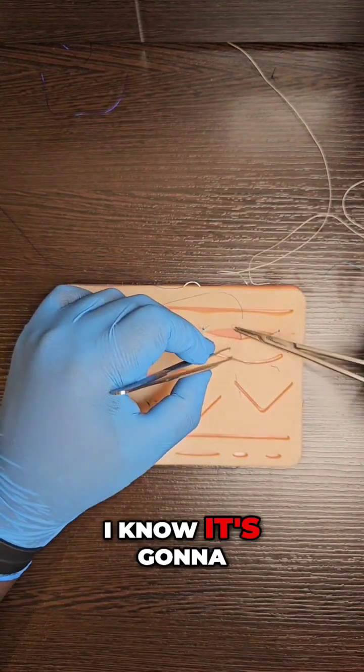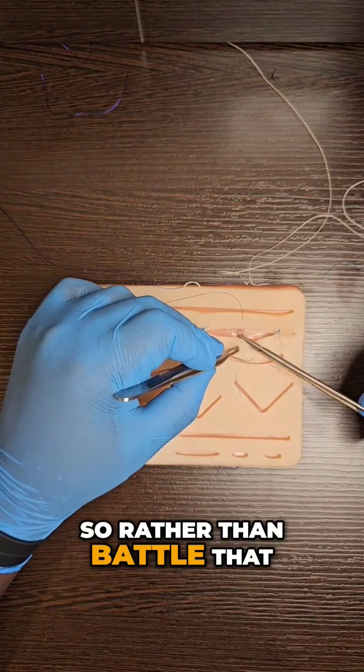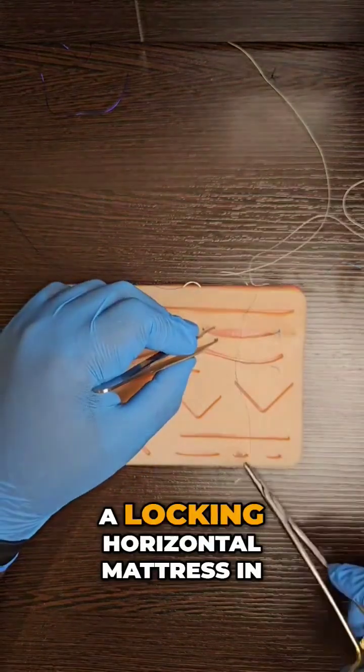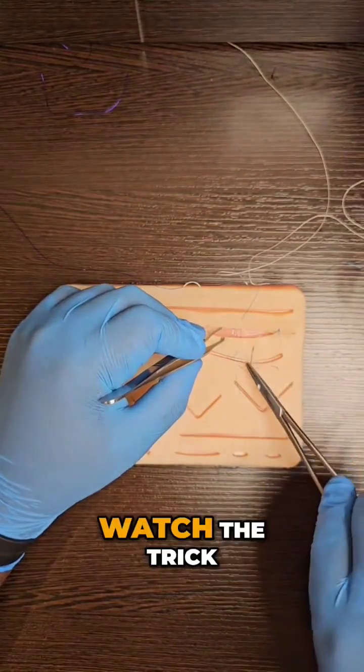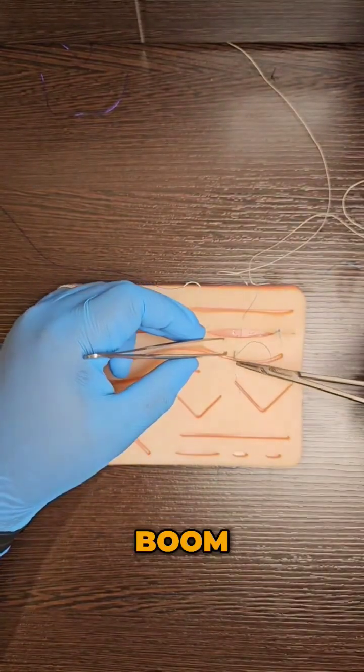I know it's going to be tricky to close, so rather than battle that, I'm going to put a locking horizontal mattress in. Watch the trick. Boom! If you got value out of that, like the feed.